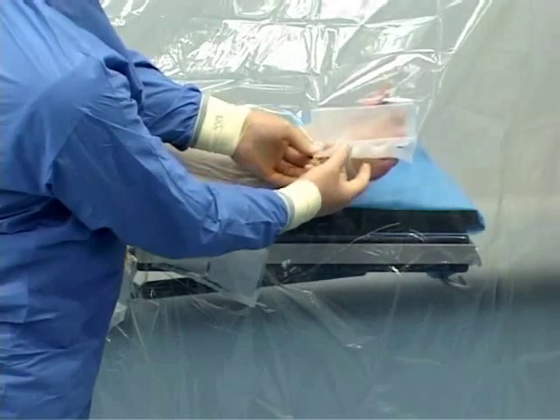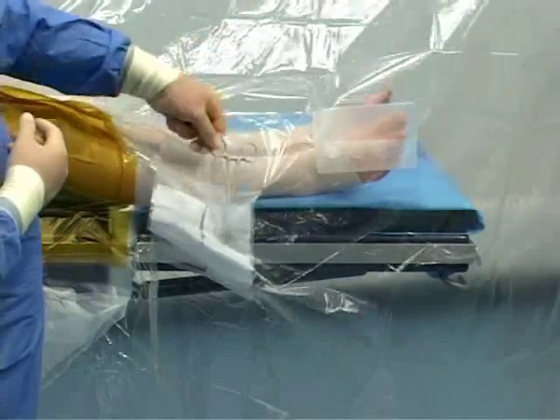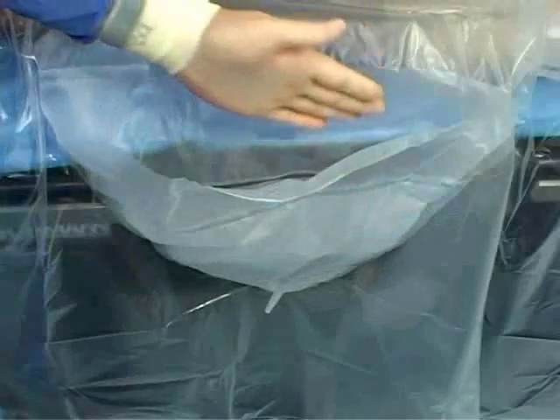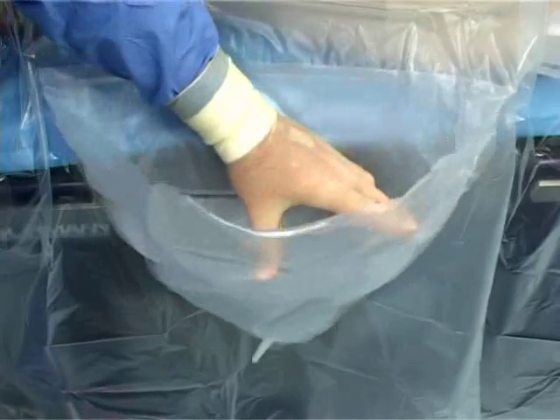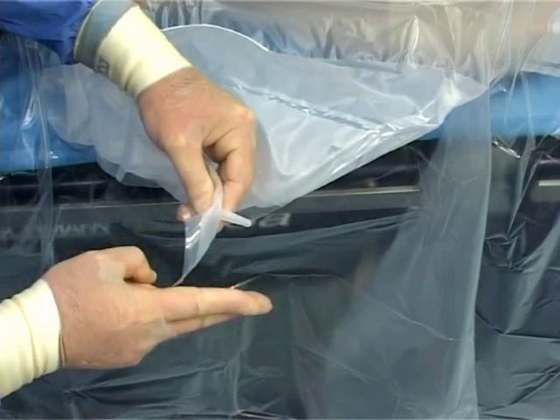There are tube organisers to secure cables and tubing, an instrument pouch for retaining instruments during the procedure, and a large fluid collection pouch with filter and suction port which can be cut and attached to the suction machine.